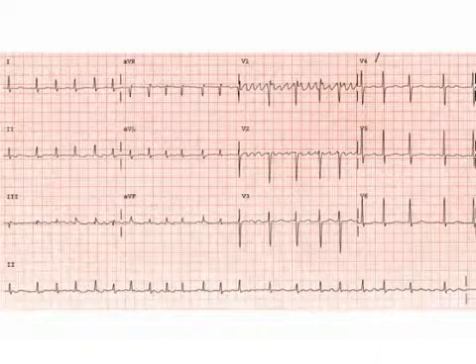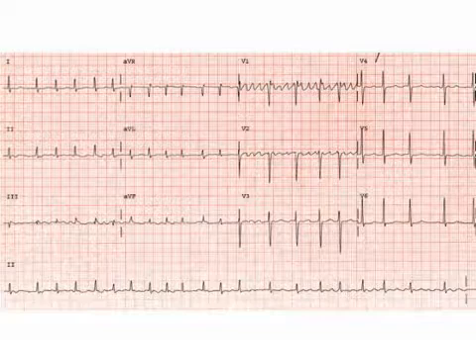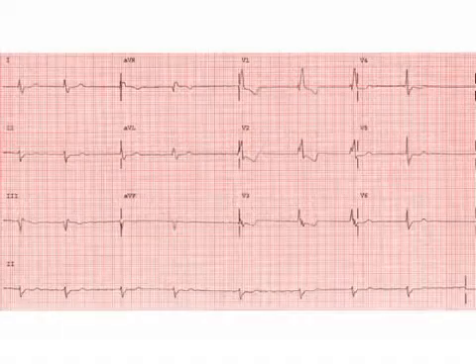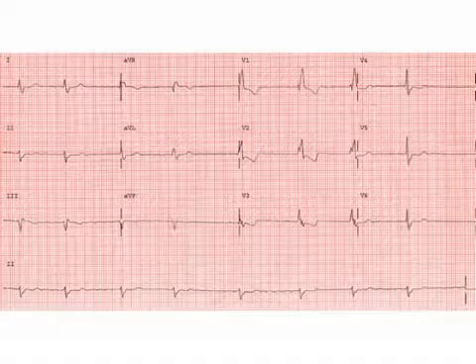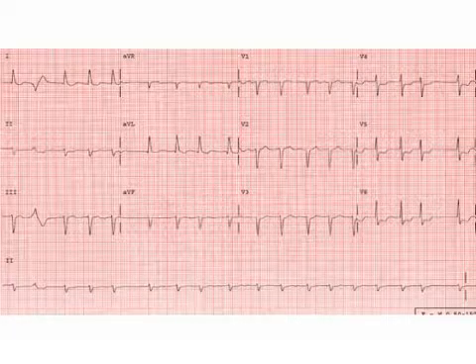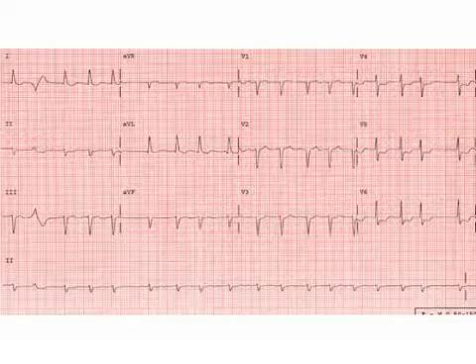The next 3 examples will focus on atrial fibrillation. When you look at the hallmark of atrial fibrillation, look at a few things: one, lack of P waves, and then also an irregular rate and rhythm. So as you go through these examples, there are no P waves, and as you march out the rhythm with a caliper, the rhythm is irregularly irregular.